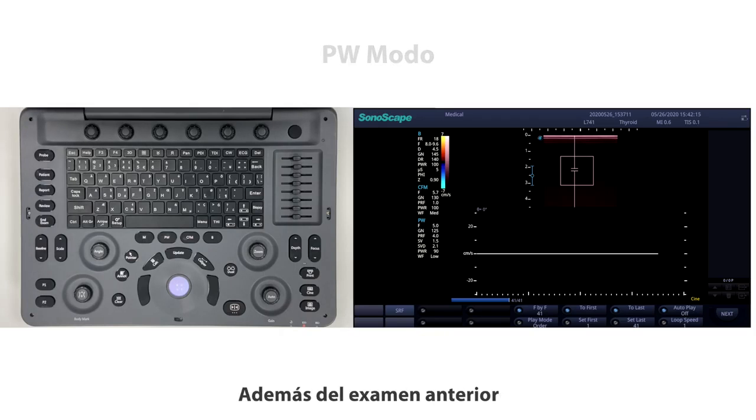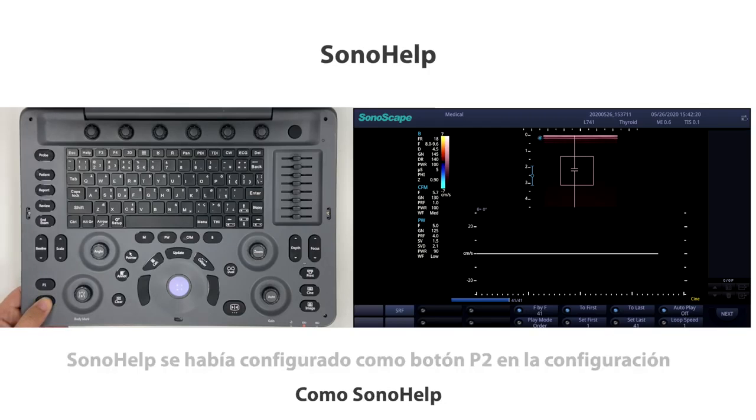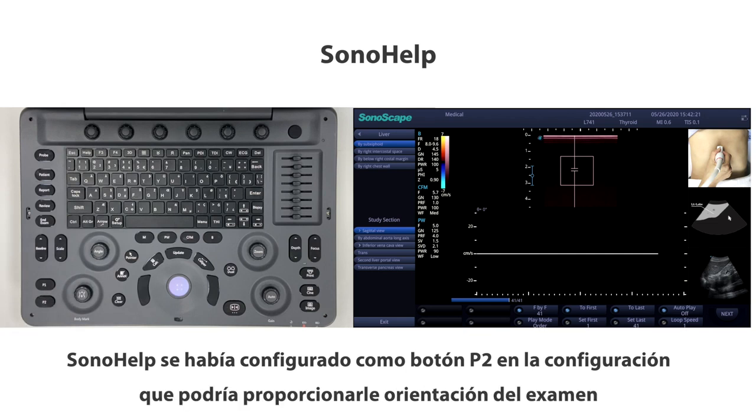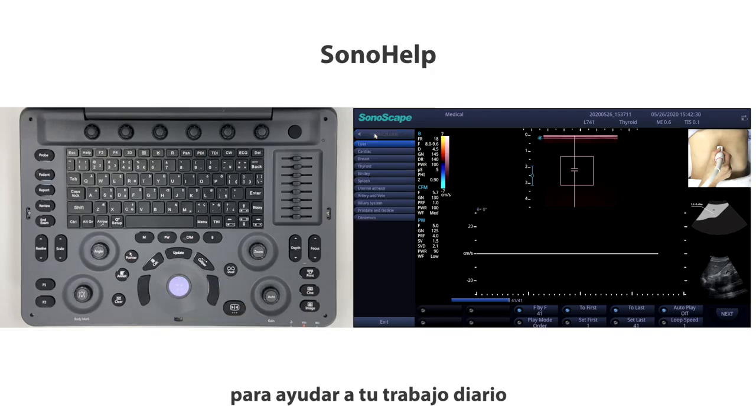Besides the examination above, E-Series is also equipped with practical functions for your efficiency, such as Sono Help, which could provide you guidance of exam. Other valuable function buttons are also displayed on the keyboard to help your daily work.